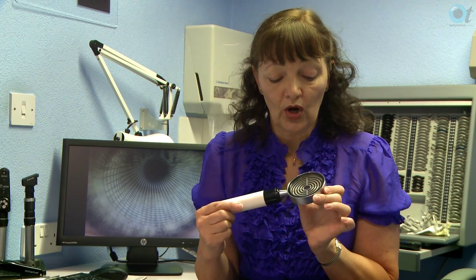So let's have a look at some non-invasive break-up times. A very old-fashioned method would be to use a keratoscope and shine a grid pattern on the patient, then get the patient to blink and watch until the mires distort. You can do this on a keratometer, and what you need is a stopwatch.